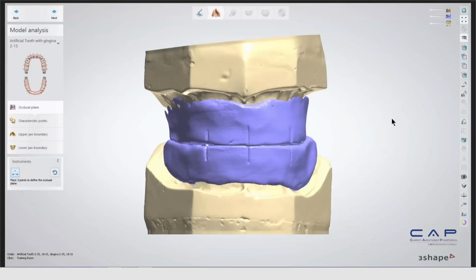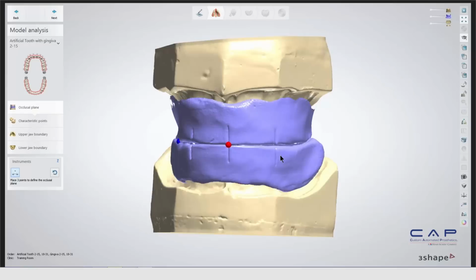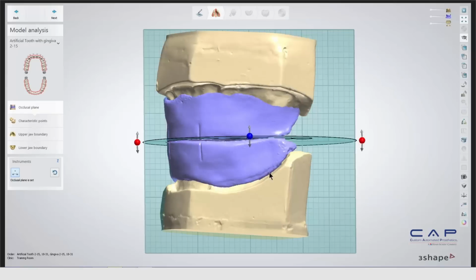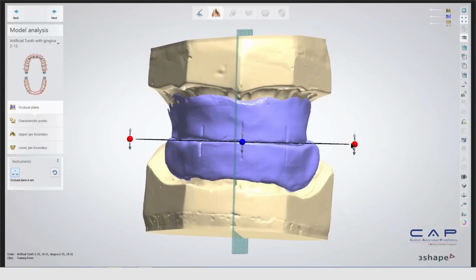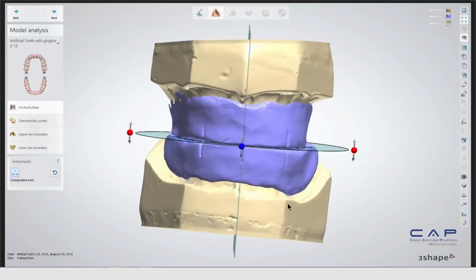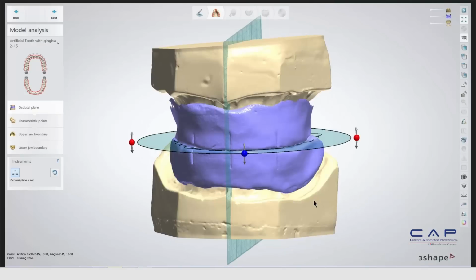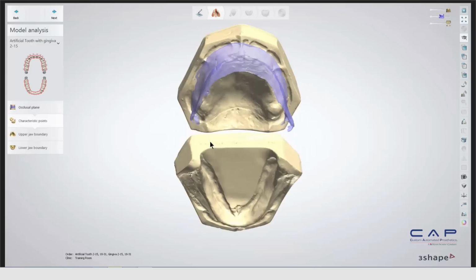So the first thing that we're going to do in our design phase is mark the occlusal planes. We're just going to pick 3 individual points for our occlusal plane. We're just going to click on the 3 flattest points that we have there. Just make sure it's nice and lined up. If I wanted to, I can adjust the pitch of my occlusal plane, and I can also adjust the sagittal plane so that it's lining up right with my midline. We want that to be exact as well. Okay. Now we're going to hit next and move on to our characteristic points.